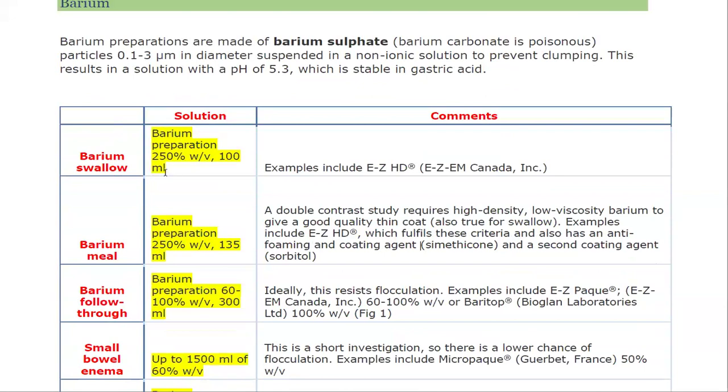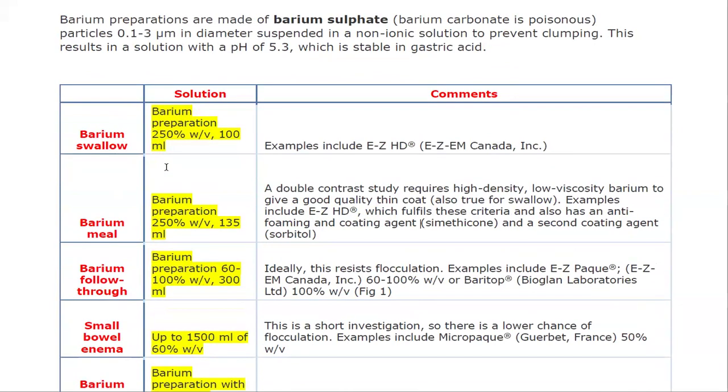As you know, the concentration is important here. You may find some information that is not necessary, but it's important in the context to know the background if you want a complete understanding. But the important point regarding the exam will be the concentration and what you use when you are selecting one of these investigations. So the variation will be in the concentration of the barium itself.